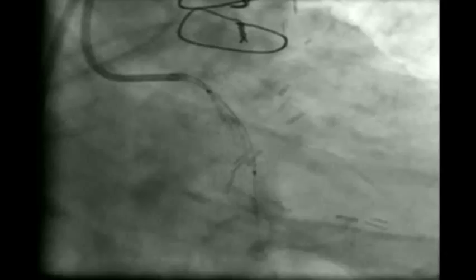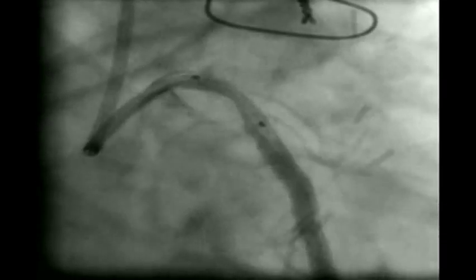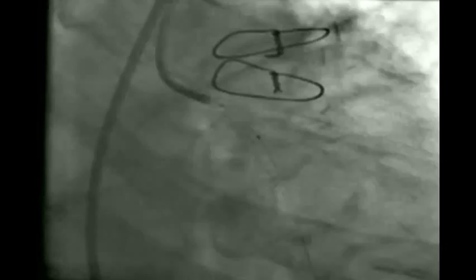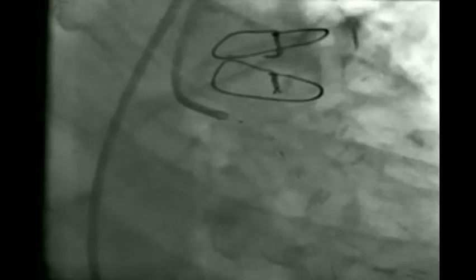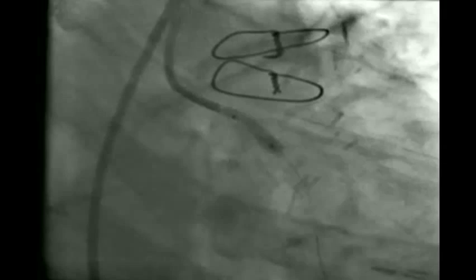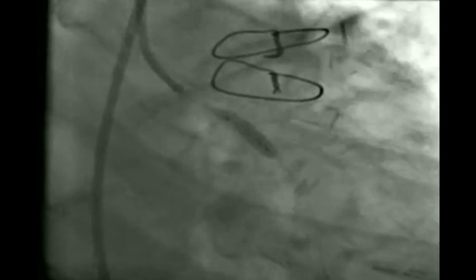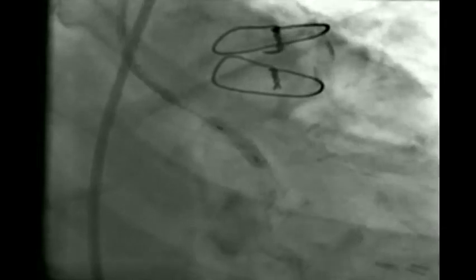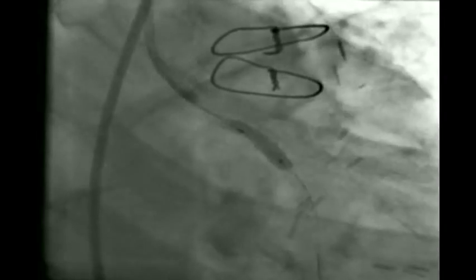We now proceed to deploy the fourth stent, proximal to the previously deployed distal stent. This required some manipulation to achieve overlap, as the stent struts of the fourth stent were getting caught in the proximal struts of the third stent. Finally, we achieved proper positioning, matching the markers of the distal and proximal stents, and deployed at 16 atm — though a residual lesion is visible.